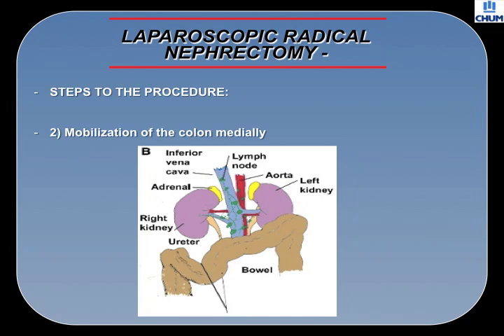Step 2: Mobilization of the Colon Medially. This aspect of the dissection is very important to create a larger working space in which to identify the kidney and perform the dissection.